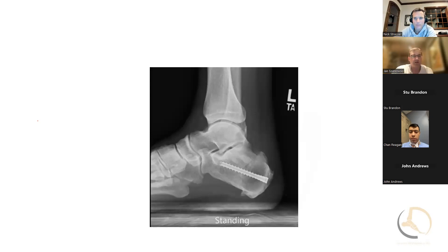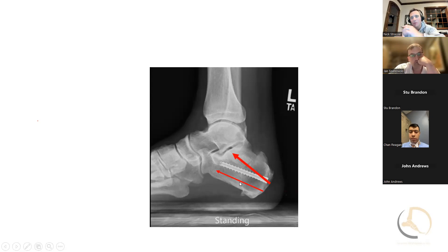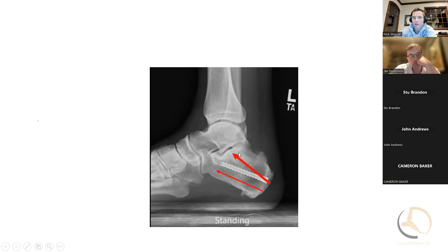If I was doing this now, I changed my screw trajectory a little bit — I'd start at the same spot, but add a second screw at the bottom. There was a question about fear of displacement or non-union — yes to both. The general thought is that if you don't green-stick that plantar surface, you need to add an additional screw. Sometimes as you go, like when you do an osteotomy and you can feel that the far cortex cracks just a little bit — if I feel that, then I add a more plantar screw for additional support. I probably should have gotten this screw up just a little bit more to get the threads into better bone on that subchondral bone.